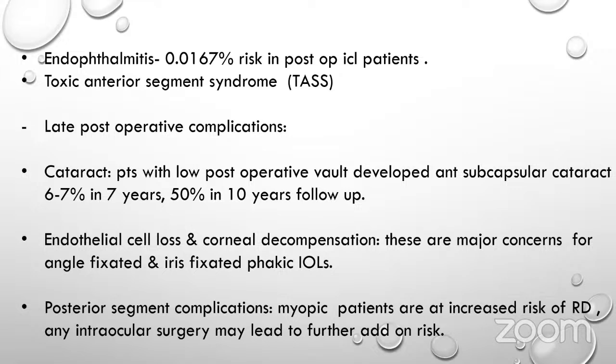These are the major concerns for angle fixated and iris fixated phakic IOLs. Iris fixated and angle fixated IOLs are long gone now. Nobody uses these IOLs. They are not even available. And the incidence of subcapsular cataract is too high.